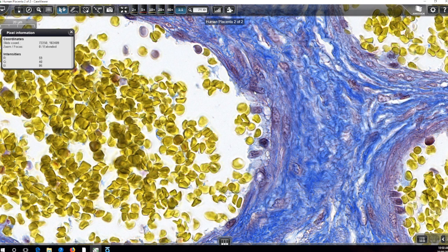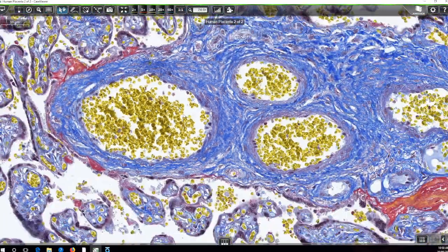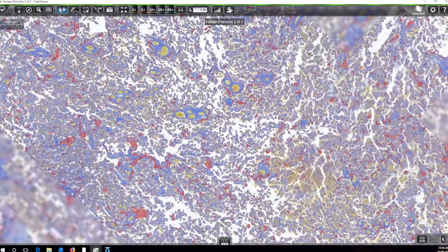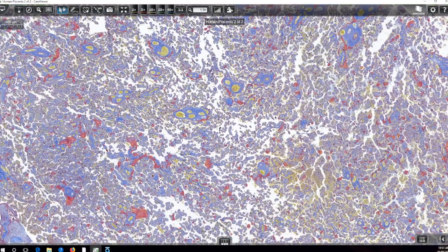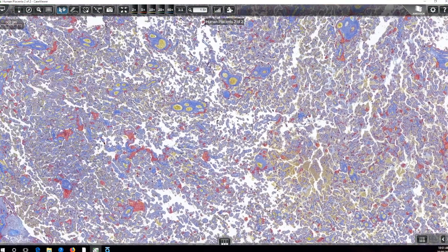So within a digital image white is a combination of red, green, and blue. If we hold over a dark area like here then the numbers are very low, and then depending upon whether it's over say yellow or blue we get different mixtures of those three channels. So there is that potential there for those who are interested to obtain some relative information about the level of color in those three channels of red, green, and blue.